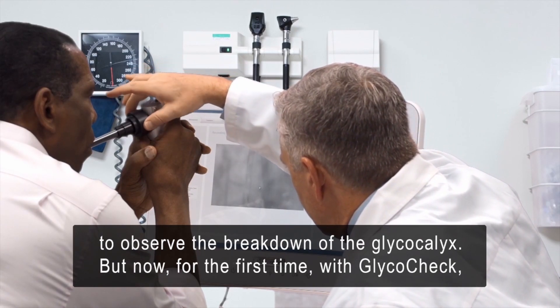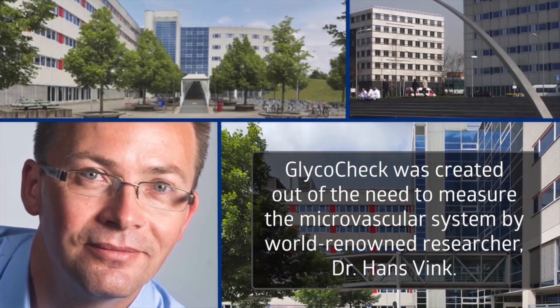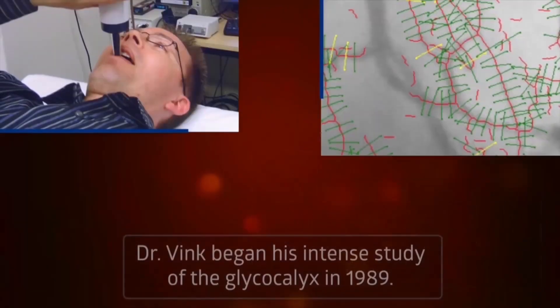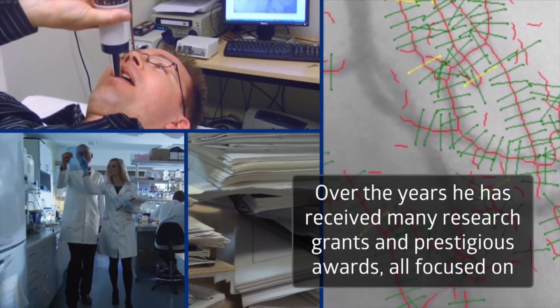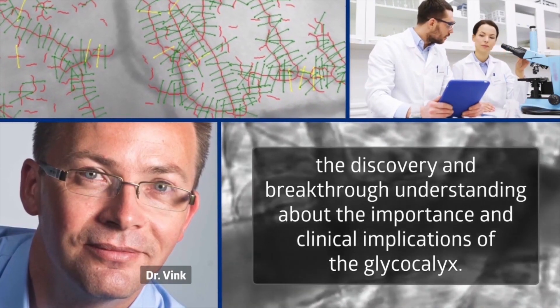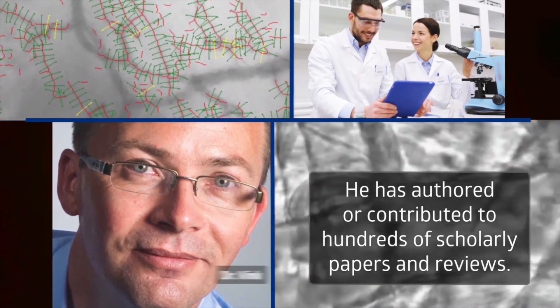But now, for the first time with GlycoCheck, it's possible to see live movement of red blood cells as they travel through microvessels. GlycoCheck was created out of the need to measure the microvascular system by world-renowned researcher Dr. Hans Vink. Dr. Vink began his intense study of the glycocalyx in 1989. Over the years, he has received many research grants and prestigious awards, all focused on the discovery and breakthrough understanding about the importance and clinical implications of the glycocalyx. He has authored or contributed to hundreds of scholarly papers and reviews.